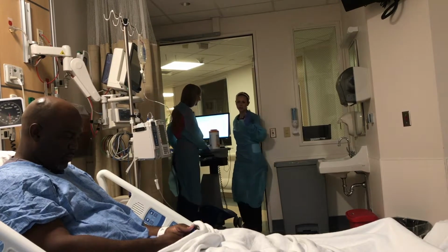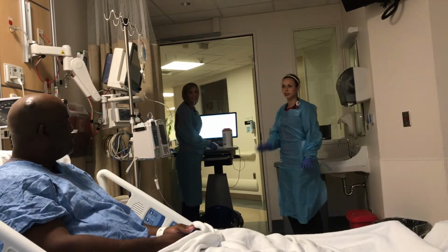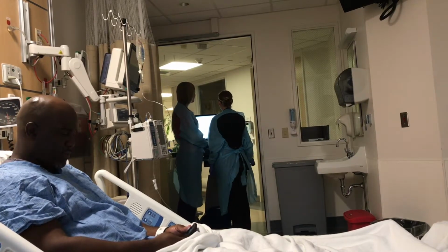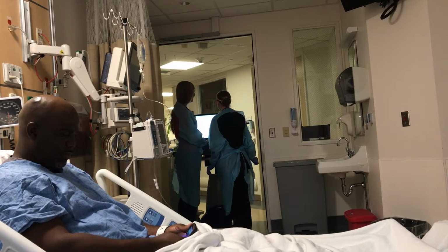Hello, my name is Jess. I'm just helping Margaret do a co-signature on a medication. Okay, thank you. So here's the order. It's heparin at 2,000 units an hour.